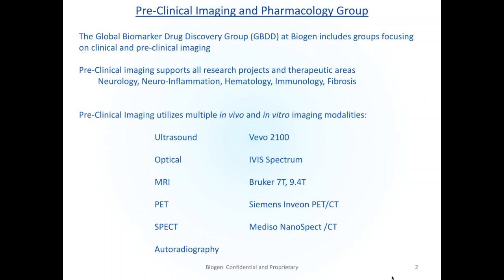And so the story here is that it turned out that ultrasound was giving us some very useful readouts on the skin models, but not shown here, for some of these studies, we also did some optical multimodal imaging on the same series of mice, trying to look at other readouts using some of these other modalities. For this particular set of models, it actually turned out that the ultrasound was really giving us very, very useful information.